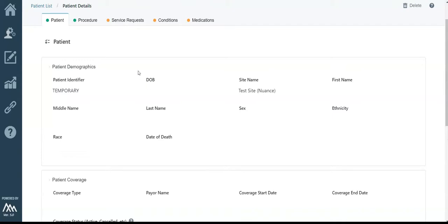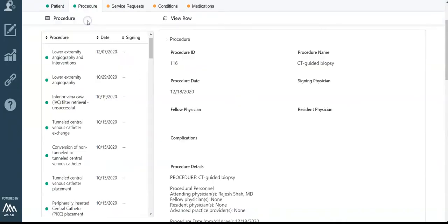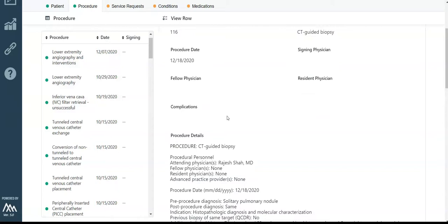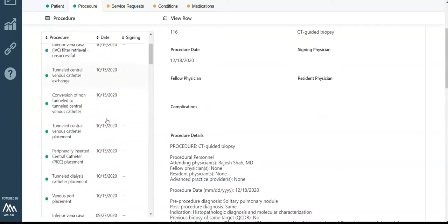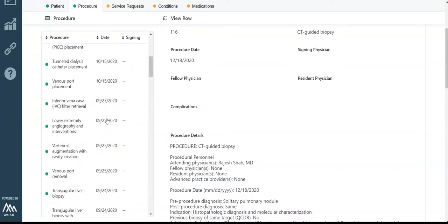Let's look at the procedure data. Each row on the table on the left is a separate procedure. Again, all of this will be imported already via your reporting system and EHR. Click on a procedure to see more details.